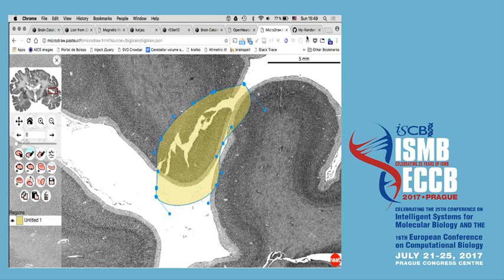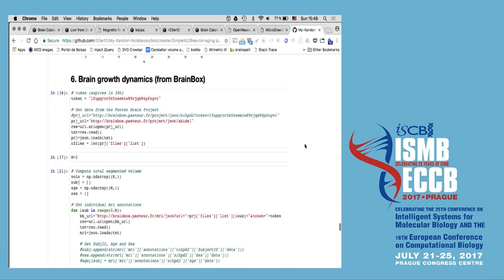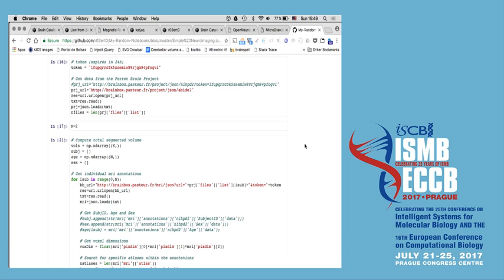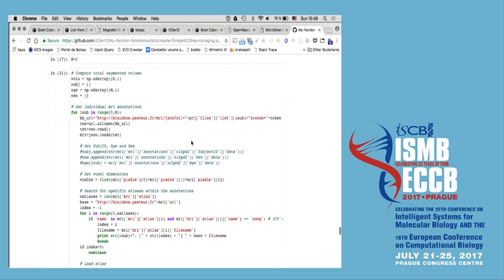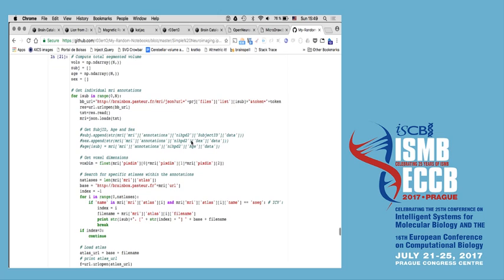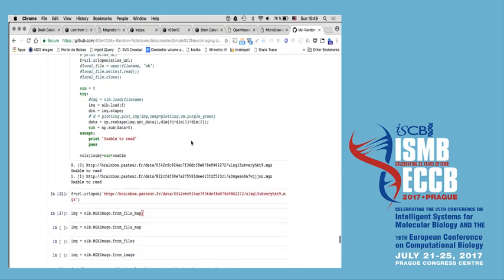Okay, so as I said, there's an API, which allows us to have access to all the data through, for example, a Jupyter notebook. Here we are getting a token; they expire in 24 hours, so you have to be quick. And we can get all the data for a specific project and then launch a pipeline that will take the most recent community curated version of that segmentation and go through the statistical analysis.